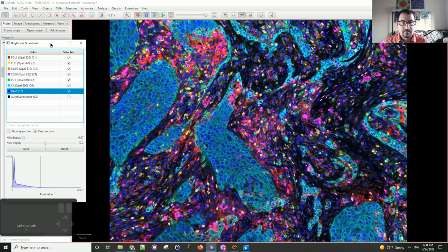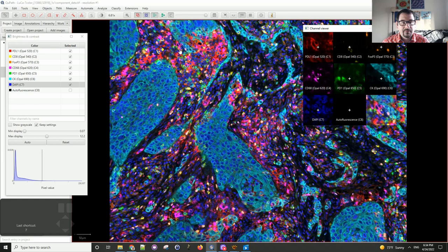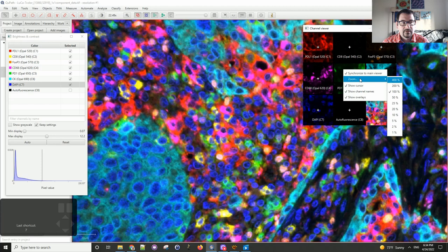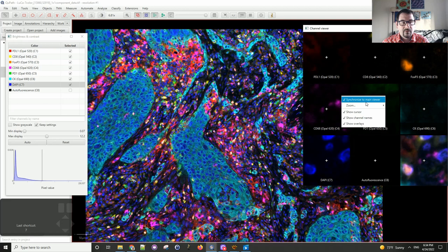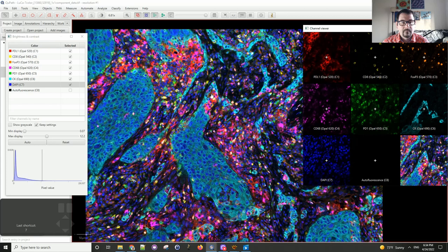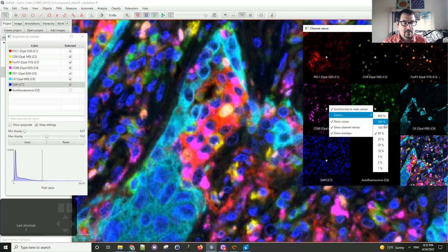One very useful tool in QPath is the Channel Viewer. This tool allows you to look at individual channels while you're browsing a bigger dataset. You can right click on it and change the zoom level — so if you want to see a very magnified image when you're looking from far away, that's one way to use it. Or you can have an overview image when you're zooming in. There are many different ways to use this tool of course.